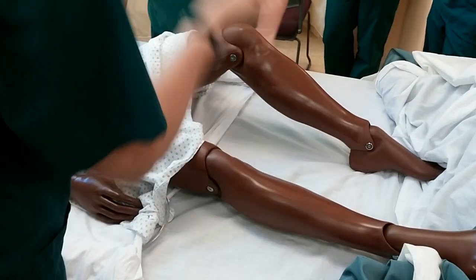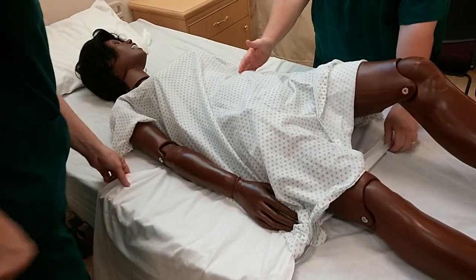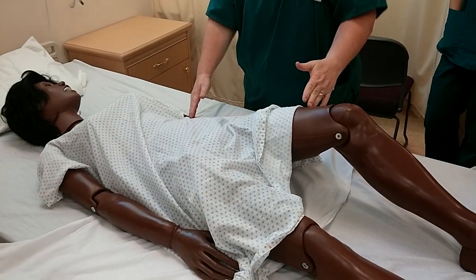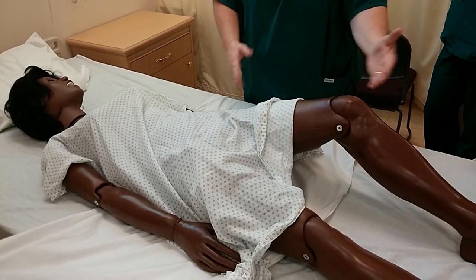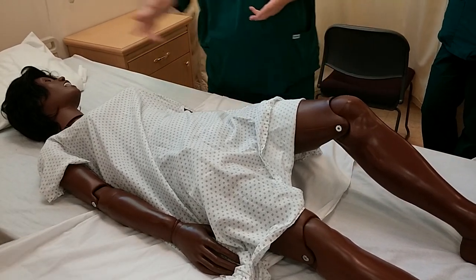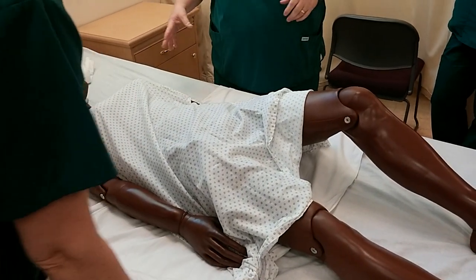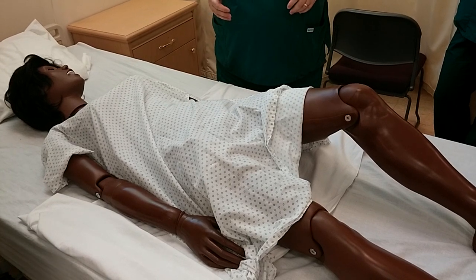If you notice the position of the turn sheet, it is about mid-waist to about mid-thigh — this is where the most weight of the body is. If you have it too low, you might move that part of the body up but you're shearing skin on the top part. Or if you have it too far on top, then you're shearing skin on the bottom as you're dragging that part of the body.